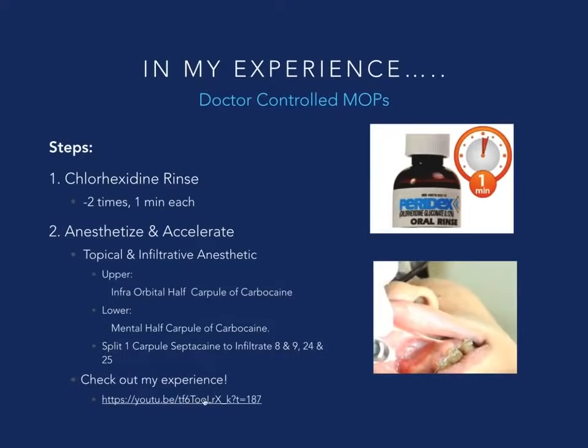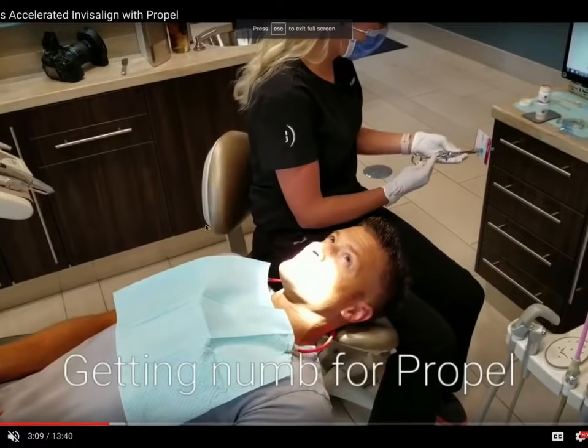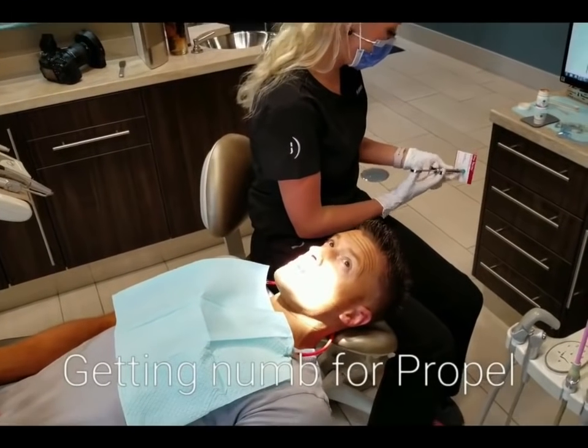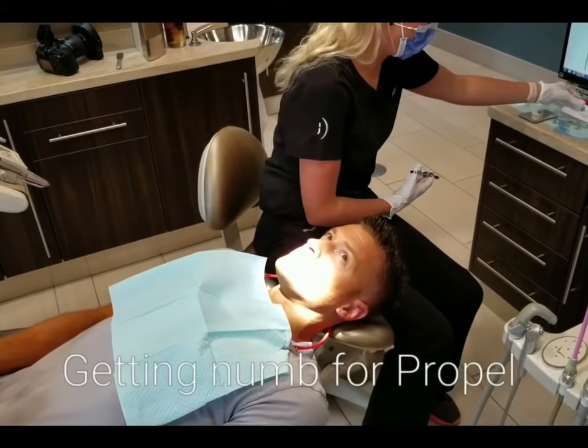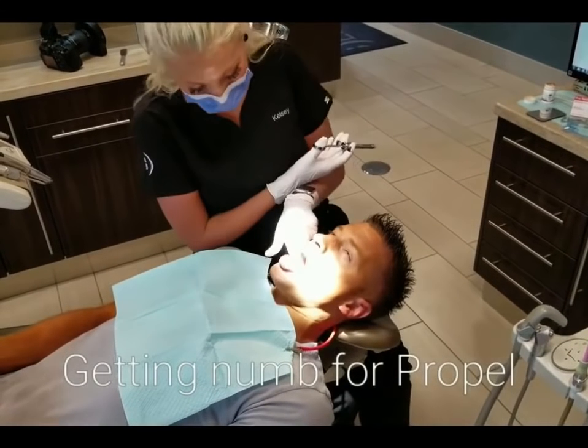I think we'll go ahead and take a split to our video that shows myself getting some anesthetic here. So there you go, you can see me, and this is Kelsey, one of our hygienists. She's going to give me anesthetic for Propel.